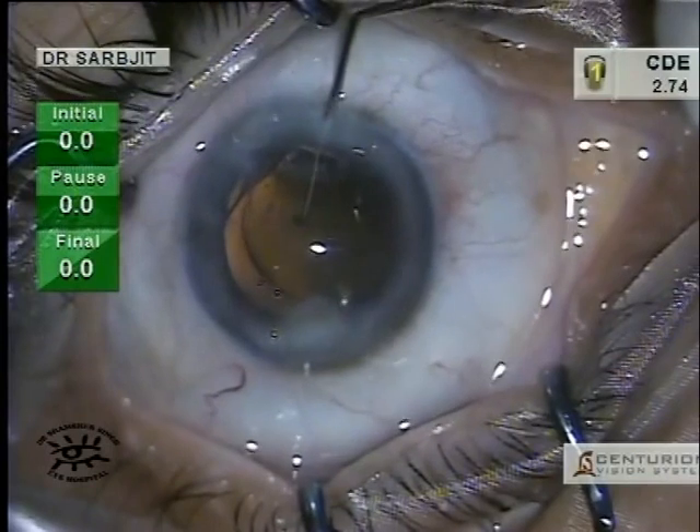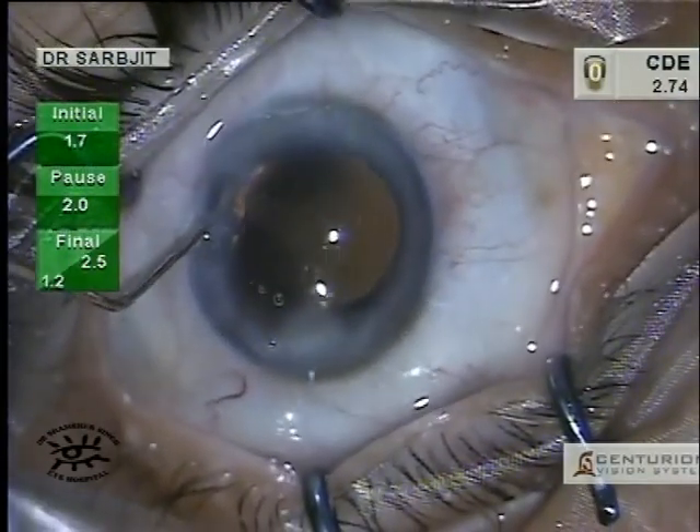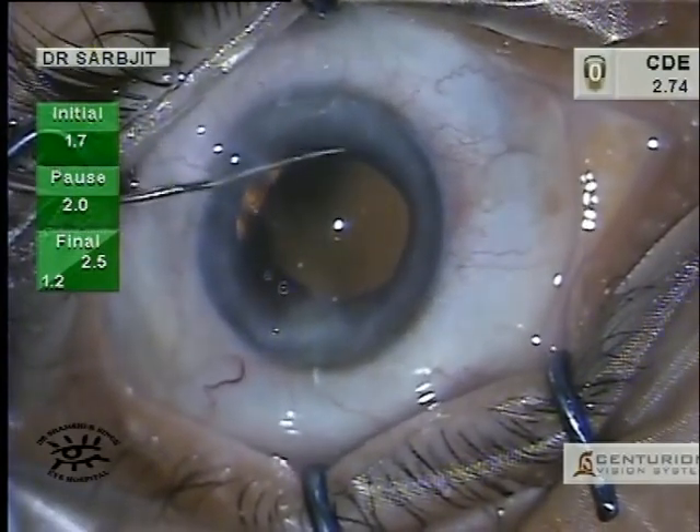Once the lens is in, just make sure that it is in the bag and quite well centered.